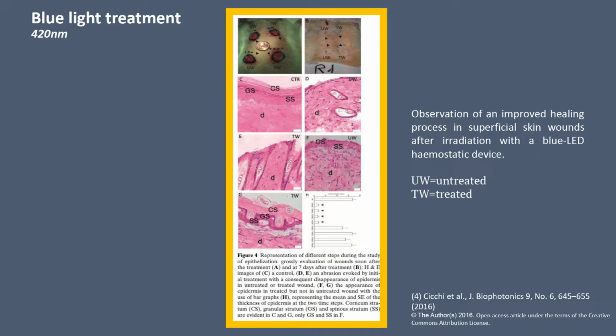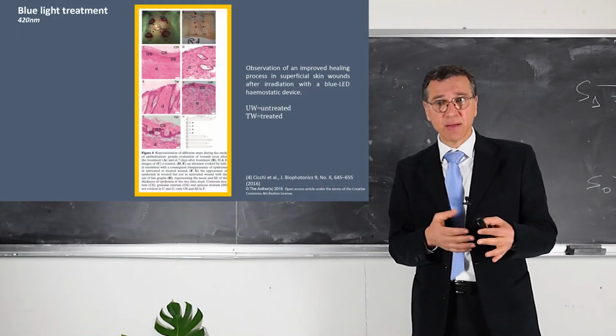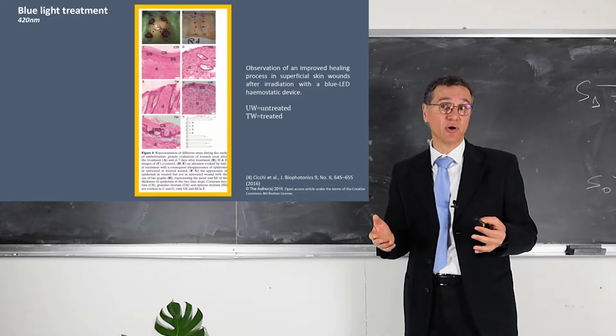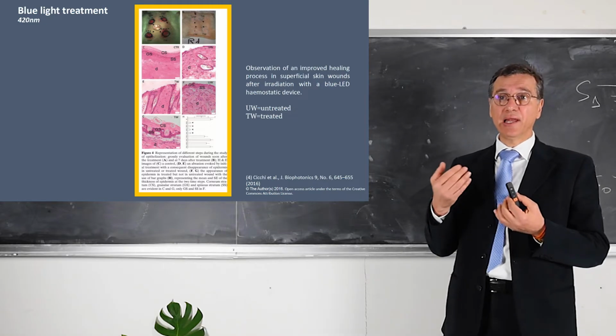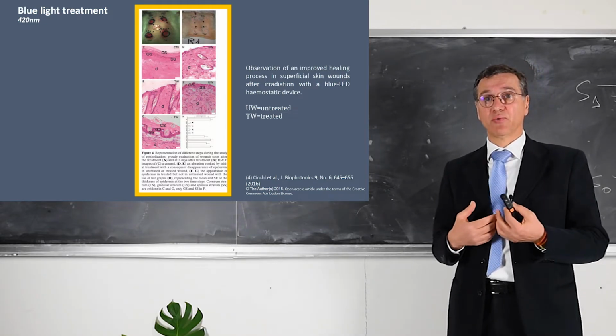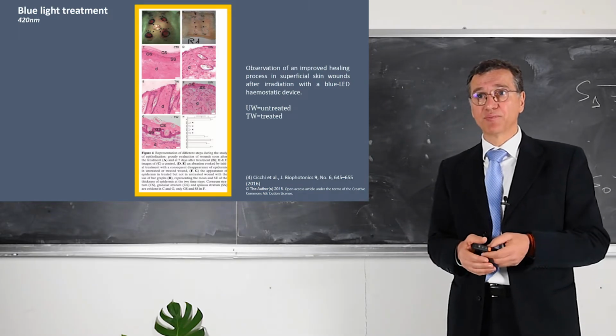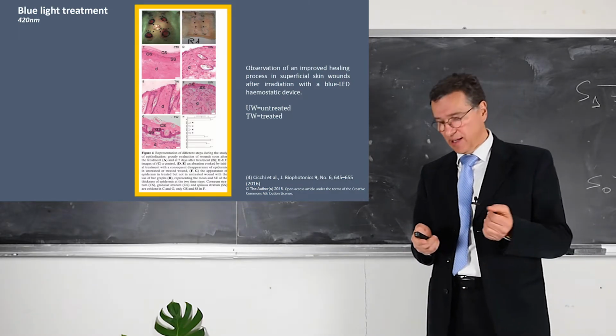Here you can see all the results summarized in terms of histology and in terms of healing. This is very visible on the skin, how the healing process works with 420 nanometers. After a few weeks, we may observe a complete healing process.